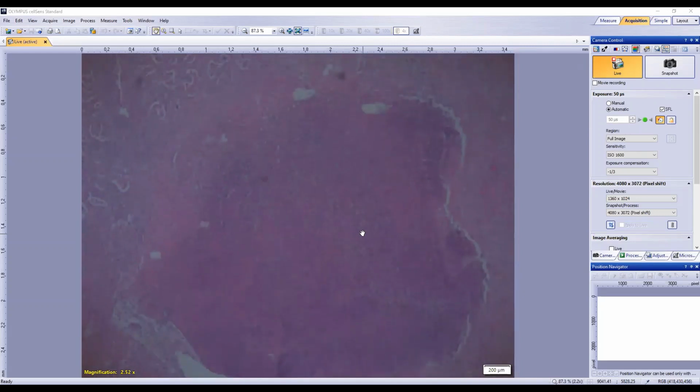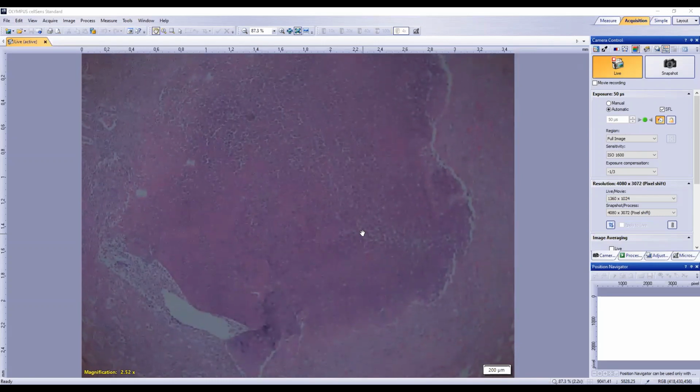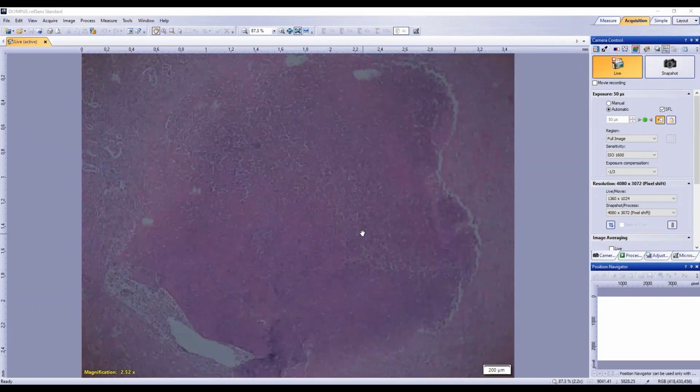But this was multifocal, and the amount of nodulation in the lung grossly was not really great. So we initially thought that it is definitely some sort of primary infection happening. Then the secondary Rhodococcus came up. Right.